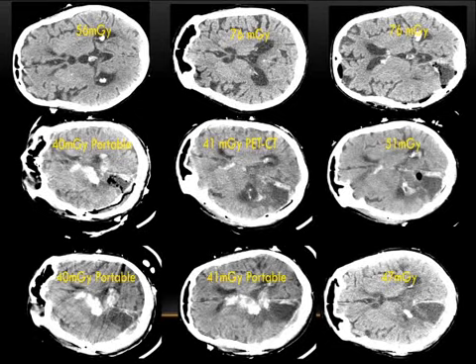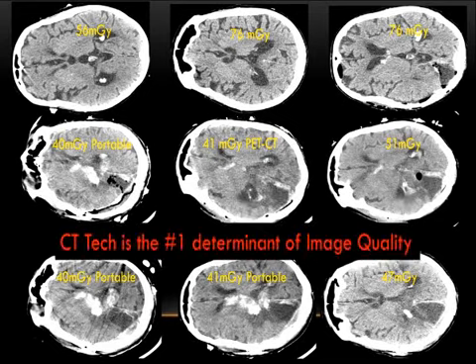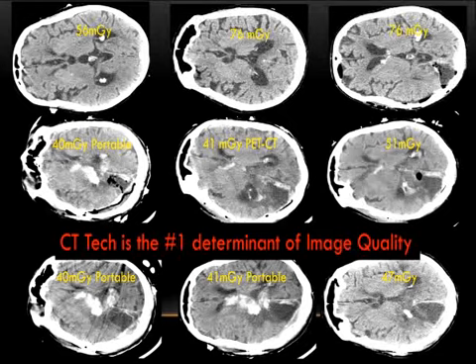In fact, these are some of the doses, and you'll find there's only a weak correlation between the image quality and the actual dose that was used. So I would go out on a limb and make a statement saying technology matters. All the nice things that the vendors do matter, but the human in the loop matters the most. Because it's the care they show in acquiring a scan that makes the scan.